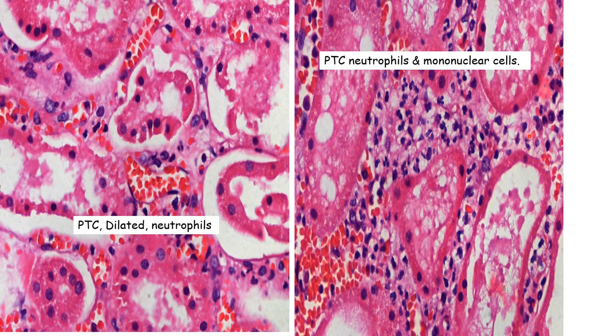Other than if you specifically search for them, you may find them in some regions. So not only do the neutrophils encircle the peritubular capillaries, but even encroach into the lumen, which is the hallmark finding of an active humoral rejection. Sometimes the neutrophils may be accompanied with lymphocytes and histiocytes. The neighboring tubules contain hemorrhagic material and show loss of the nuclei, suggesting tubular injury.